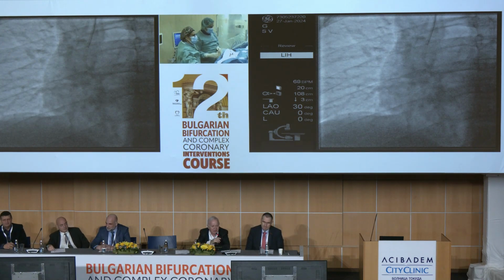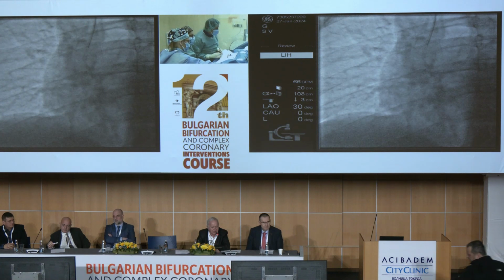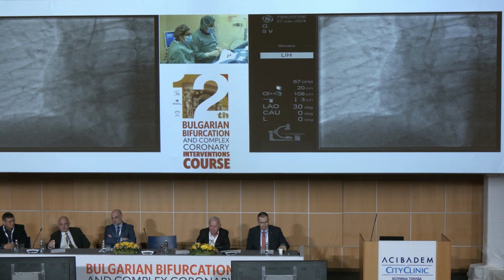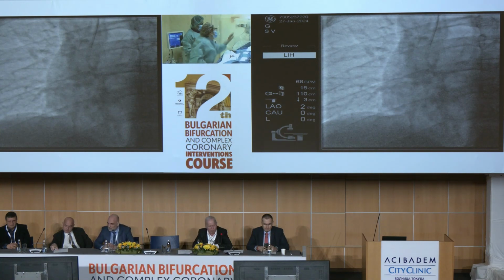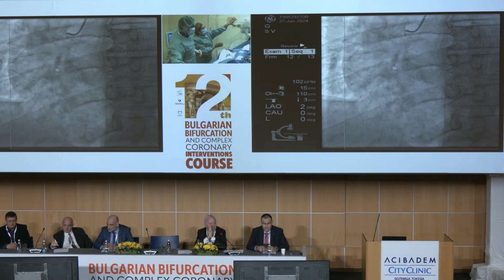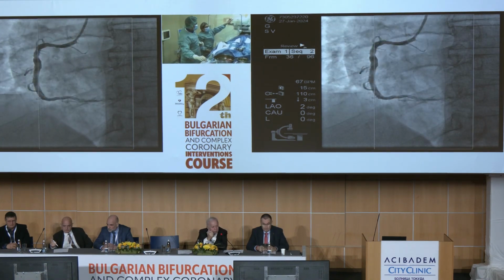We are just starting the case right now. We were looking at a few injections in the left coronary arteries. What we need to understand, to know which case you will perform now, is to have at least 3 good injections on the left. We just checked that the right coronary artery kept a good result from the last acute coronary syndrome. Now I guess we can go directly to the point. The right is okay.